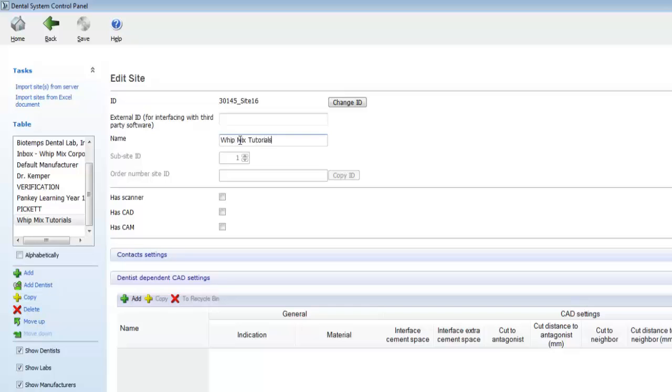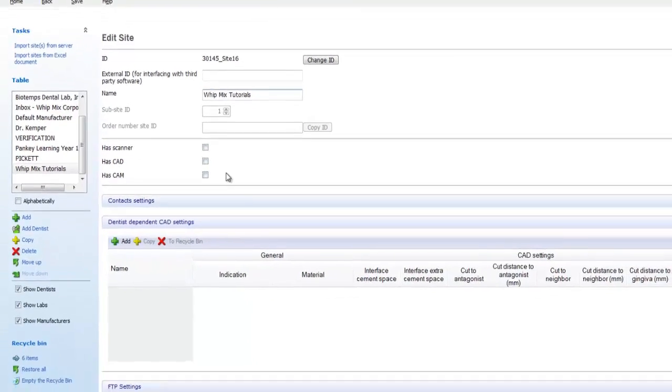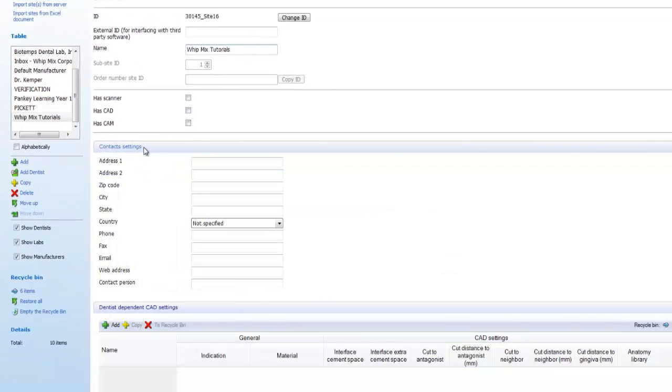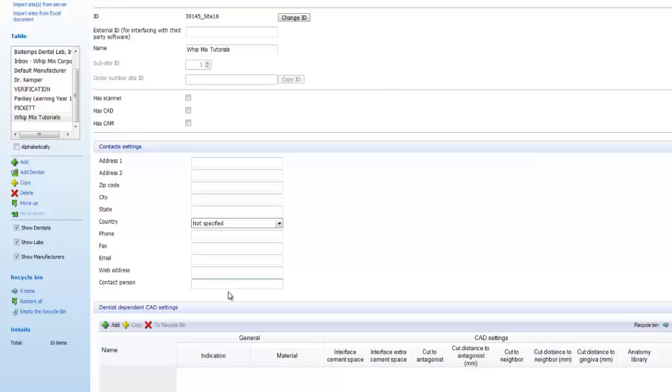Next we can check whether or not the specified person has a scanner, CAD, or CAM. Now we want to click on the text that says contact settings. This will open up contact settings, allowing us to enter more information about the lab or doctor. I only fill in the contact person, but feel free to fill in as much information as you'd like.